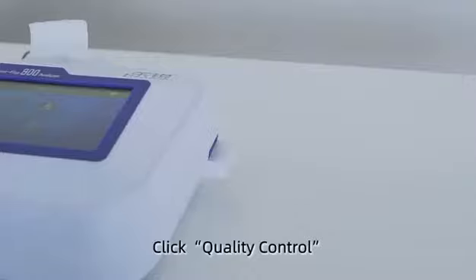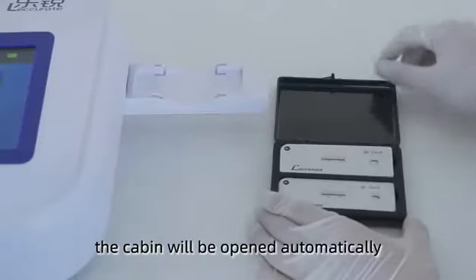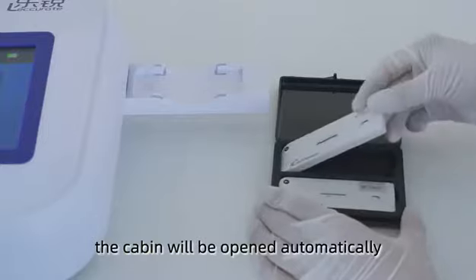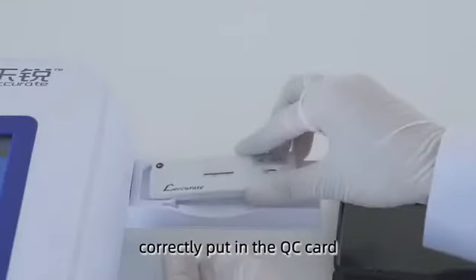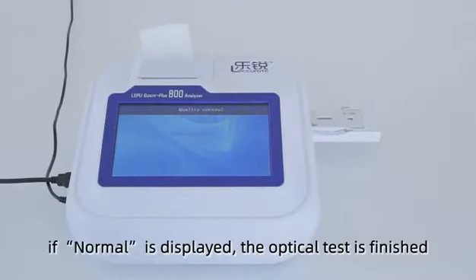Click Quality Control. The cabin will be opened automatically. Correctly put in the QC card. If normal is displayed, the optical test is finished.